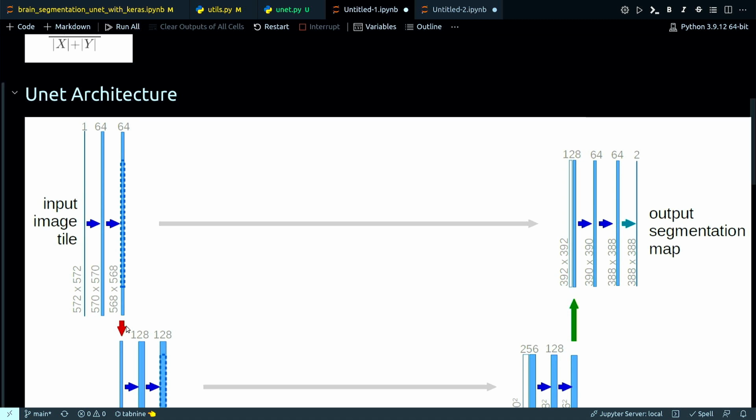From this image of the U-Net, let's take a look at the very first operation, in this section of the image. Notice that each process constitutes two convolution layers, and the number of channels changes from 1 to 64. The convolution process increases the depth of the image, and this red arrow pointing down is the max pooling process, which will halve the size of the image.